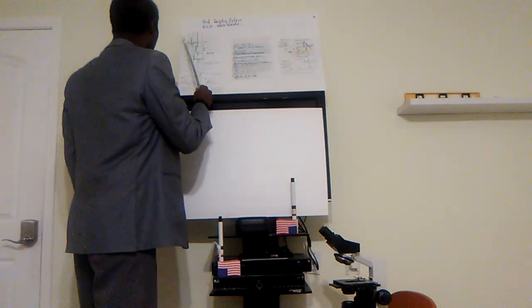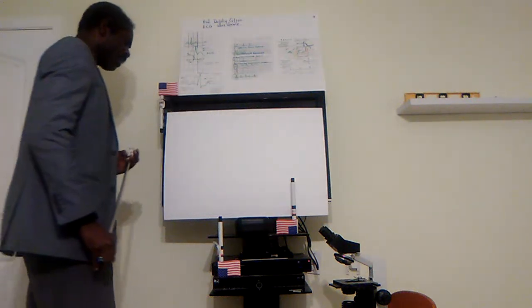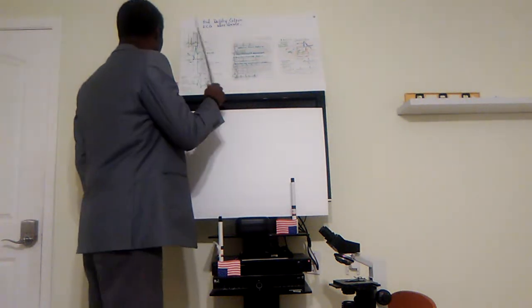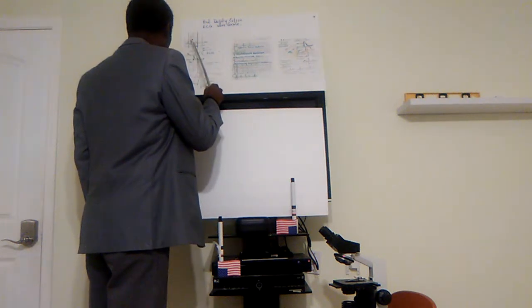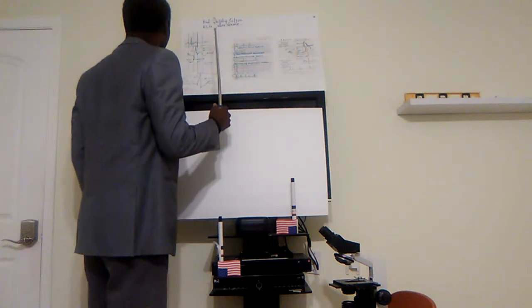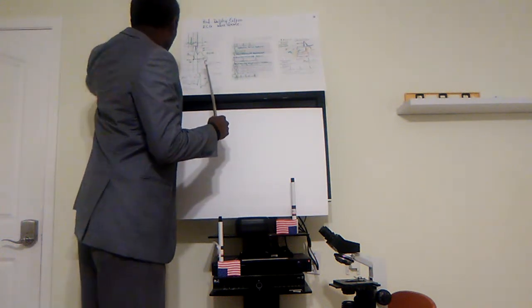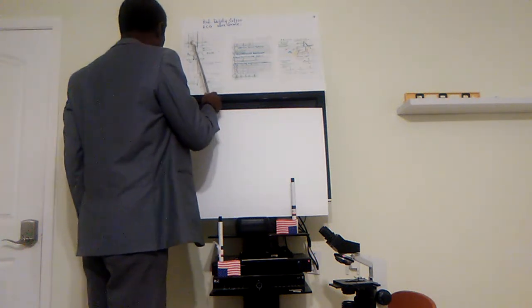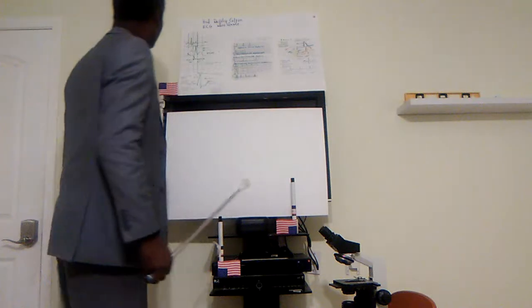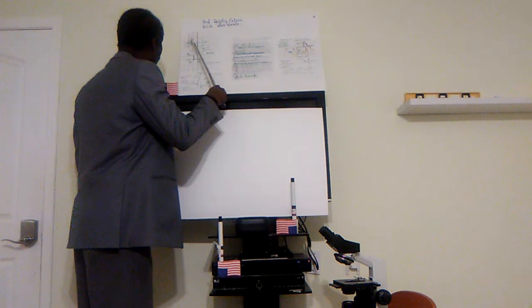So here it is, the normal ECG with the P wave, which is said to be the contraction of the atrium, the upper chamber contraction. And this straight PQ segment here is where the signal now enters into the bottom chambers, which are the ventricles, and from there you get the QRS complex, which represents the contraction of the ventricles.